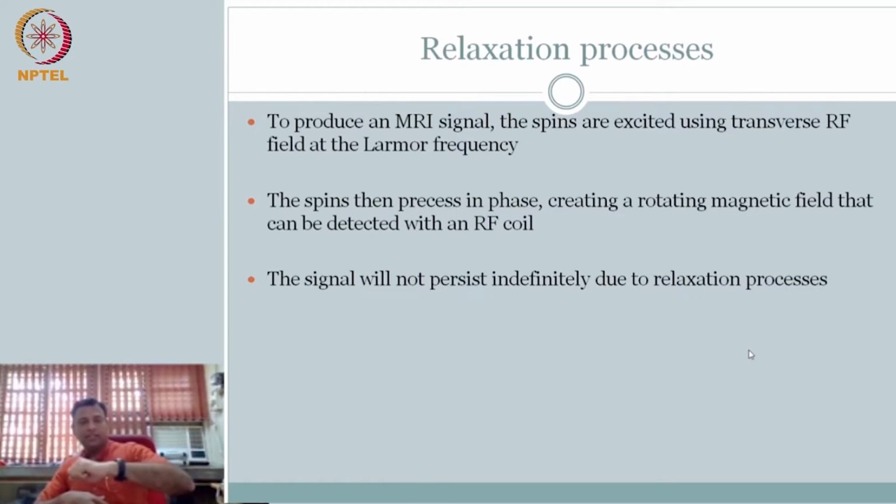So what happens is, the moment you take the excitation, they all try to obey the command only till the excitation is there. But thereon, nature kicks in. The moment the excitation pulse is off, they all start to lose their coherence. Therefore, what will happen if they lose their coherence? Signal strength will start to go. This process is called relaxation.